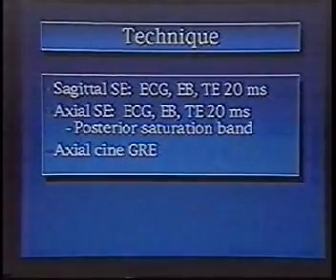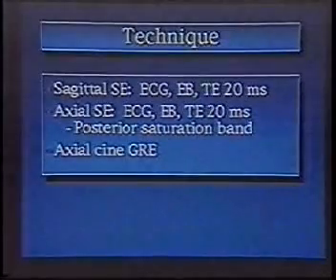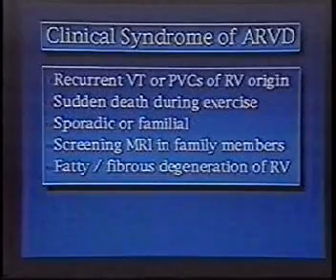Nowadays, we've started actually to do post-gadolinium images, but that's still a little bit experimental. We're not sure whether it's going to help us.